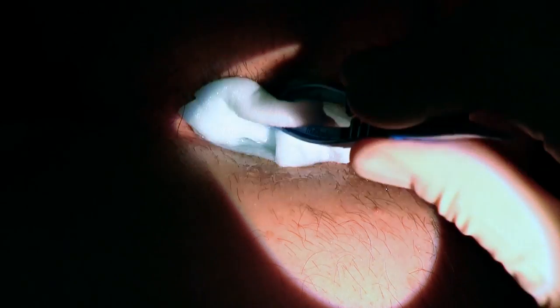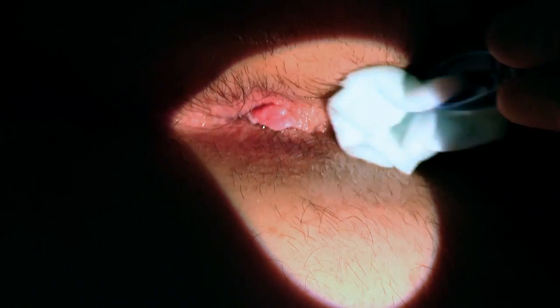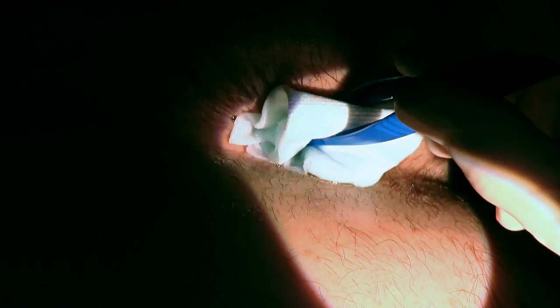Getting cold and wet again. We'll retract the buttock a little bit more vigorously, just to expose the area as best we can. This is the last antiseptic going on. Sorry about that — a little bit horrible feeling, isn't it? Is it stinging?